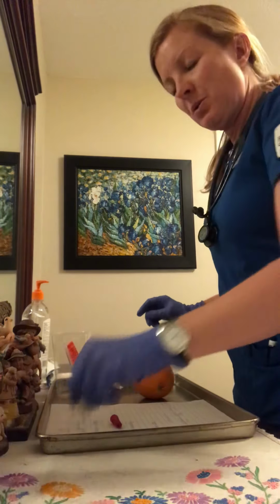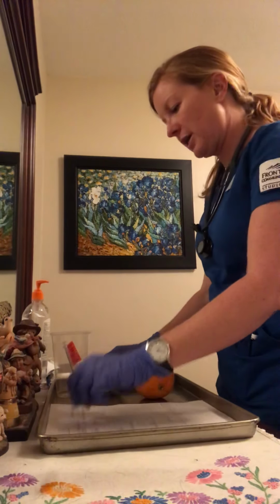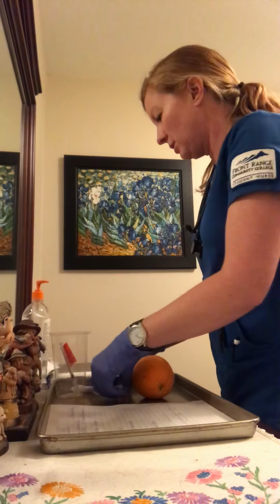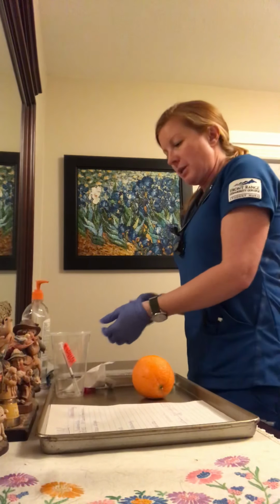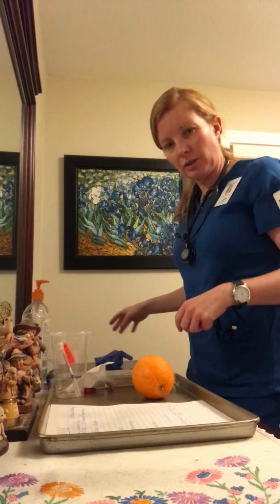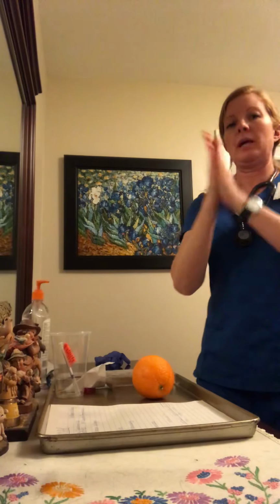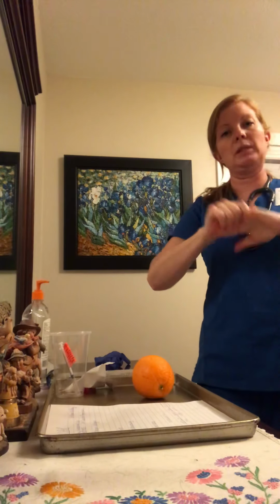And I'm going to take the vial out of the room. I'm going to gather up all my trash. This is all trash. I would take my gloves off. I would throw these in the trash also. Then I'm going to wash my hands and let the patient know that they can call if they need anything, but I would not touch anything before I left the room.